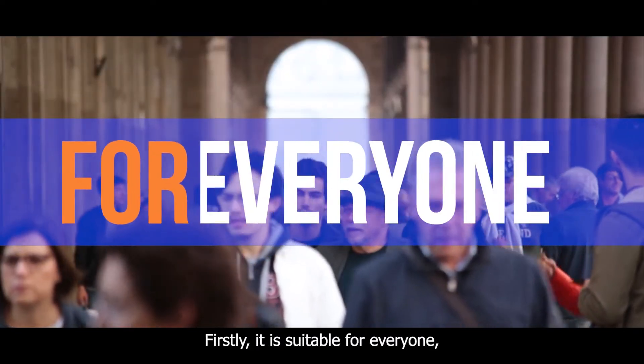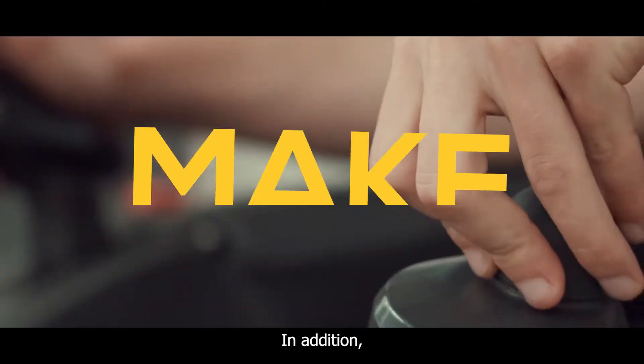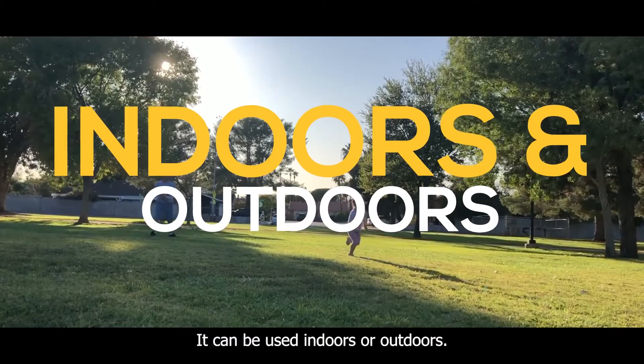Firstly, it is suitable for everyone, no matter your weight or height. In addition, it makes more places accessible. It can be used indoors or outdoors.